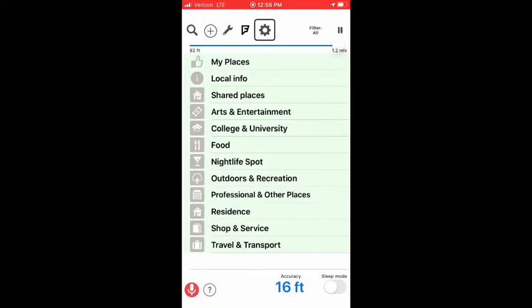But we're still walking. Should be getting closer now. Destination Hebrews Coffee, 103 S Richard Street. 190 feet at 1 o'clock. So we're getting closer now. Hebrews Coffee, 103 S Richard Street. 150 feet at 1 o'clock. Each tone has a special meaning. So if you look in the address tab, it'll tell you what all the sounds mean. 111 South Richard Street, Bedford, heading northwest.